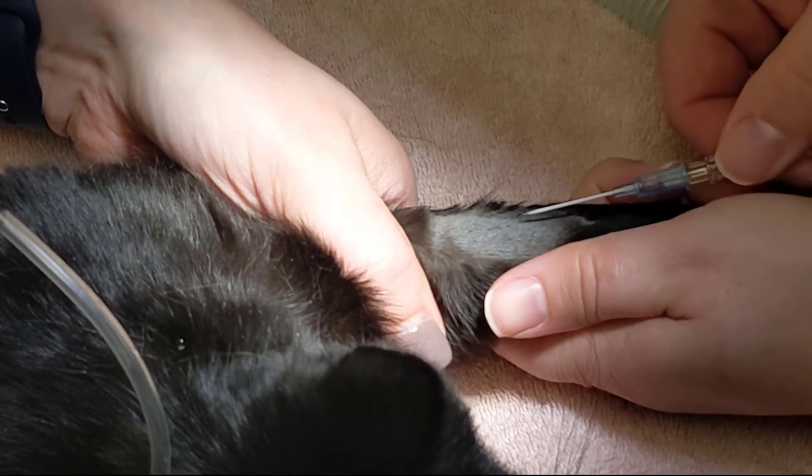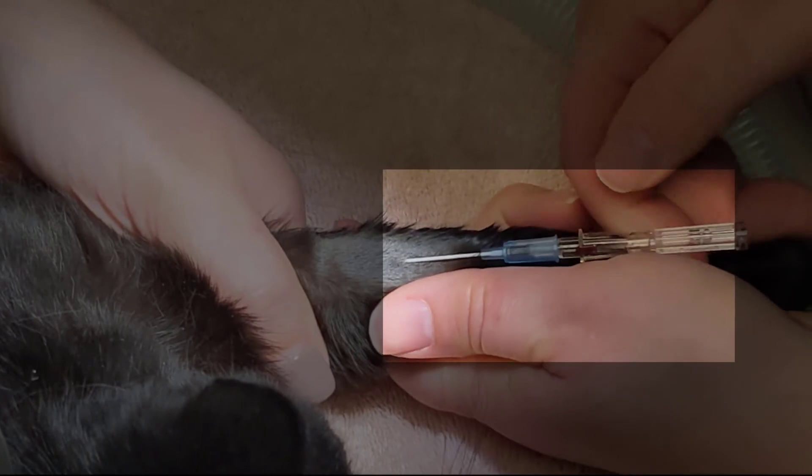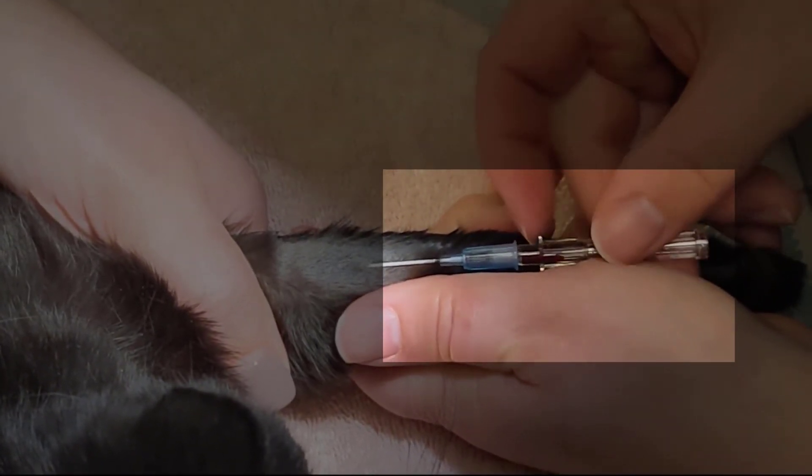Another issue you may encounter while placing catheters is a weak flow of blood after removing the stylet from the catheter. In this demonstration, the blood flashed into the chamber, but did not flow into the hub after the stylet was removed.